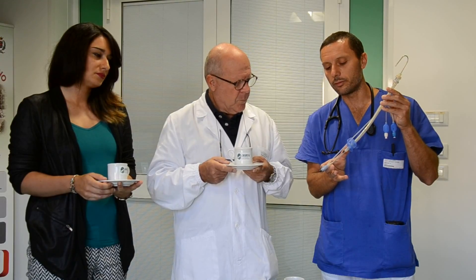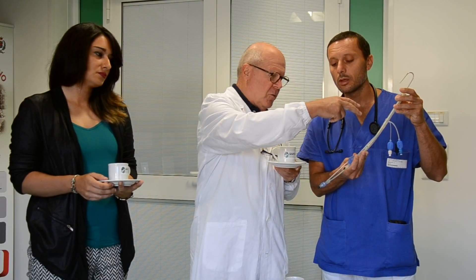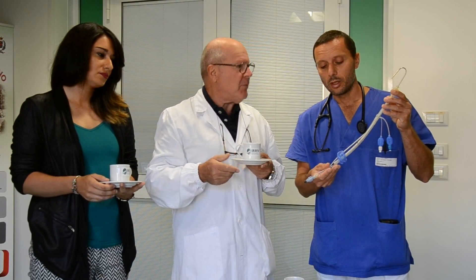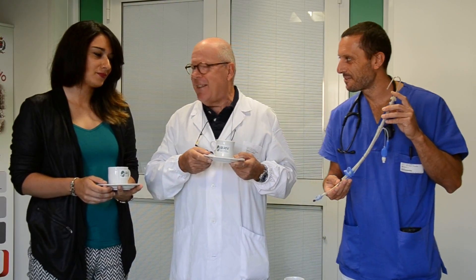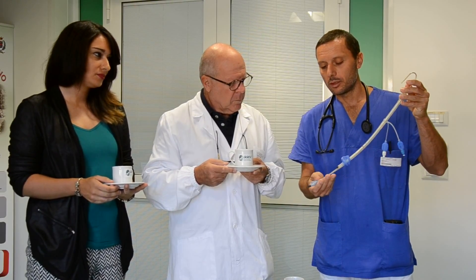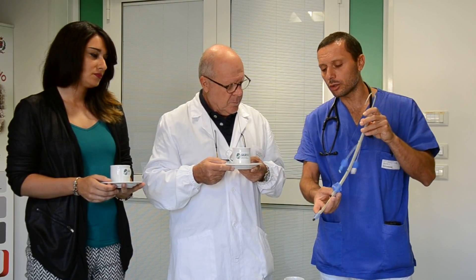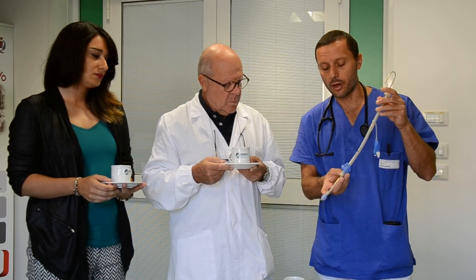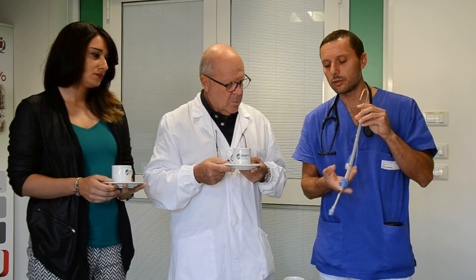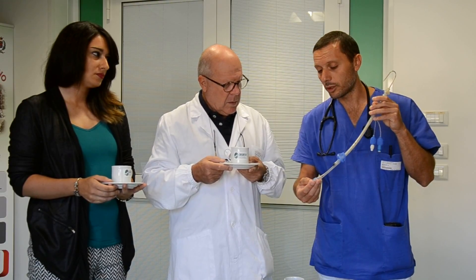When you inflate the proximal cuff, this prevents air from escaping back outside, and the air goes directly into the trachea. You can inflate the distal cuff with a separate line to stop the possibility of regurgitation. You can place it blindly, or if you encounter difficulties, you can use a laryngoscope to position the distal cuff into the esophagus.